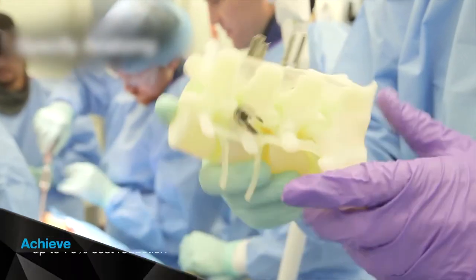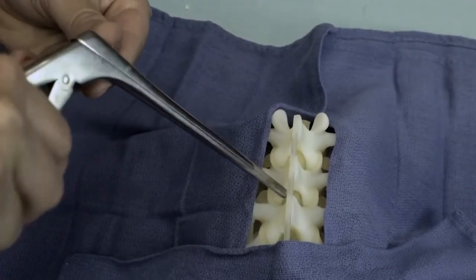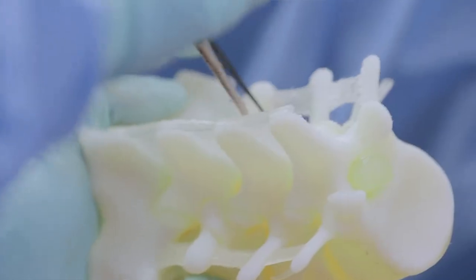Study your patient's anatomy, then plan and execute your approach before ever stepping into an operating room.